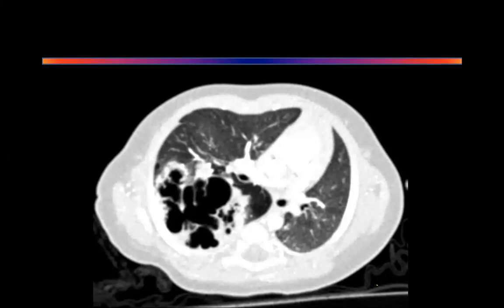Again, you are describing that butterfly to me. It could be a moth. It could be a dragonfly. The quality of the diagnosis will depend on how well you describe the insect to me. You understand that? That's the point I'm trying to make. That's why I threw the first film. So for you to understand that what you're doing in a CT scan is just describing to a blind man what you're seeing on the screen. And there is no reason why you cannot describe.